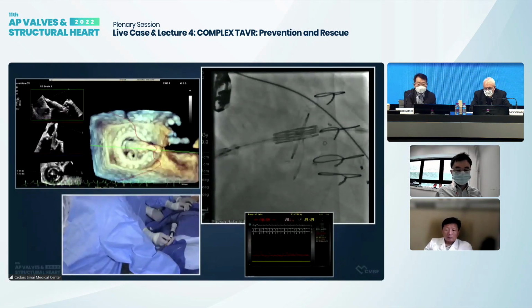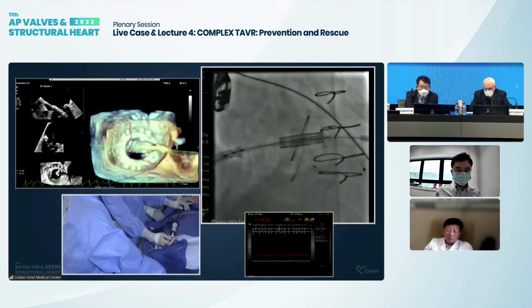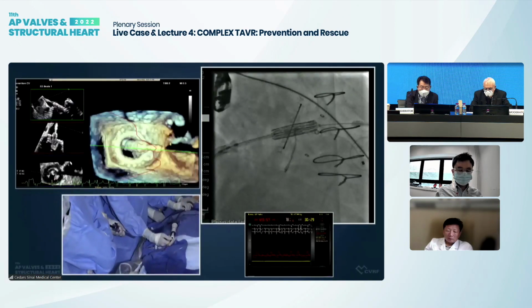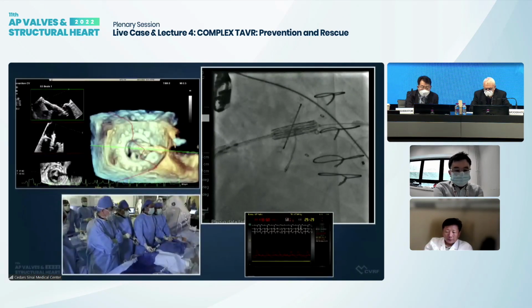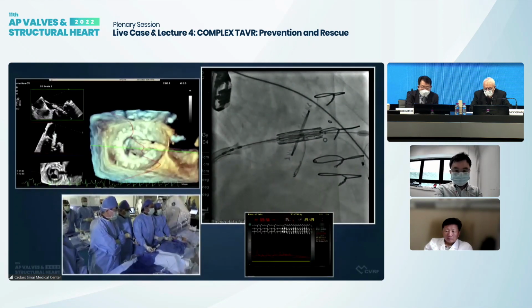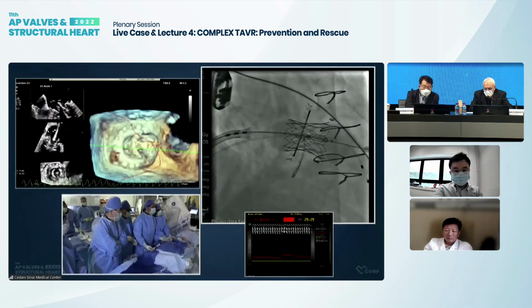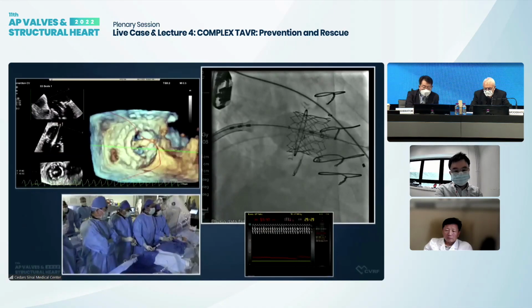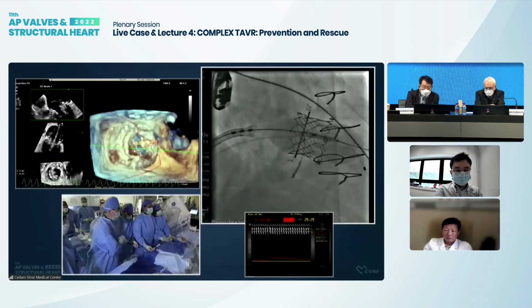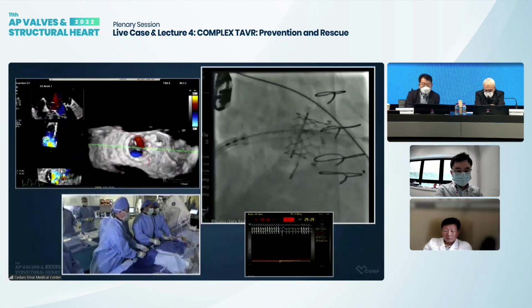Okay, let's do this, guys. I think this pusher is back far enough. Pacemaker ready? Are you ready? Okay, pacemaker on, please. Okay, let's go up, please. Very good. Very, very nice. Down. Okay, off, please. All right, very good.